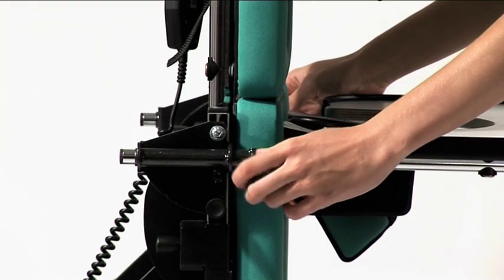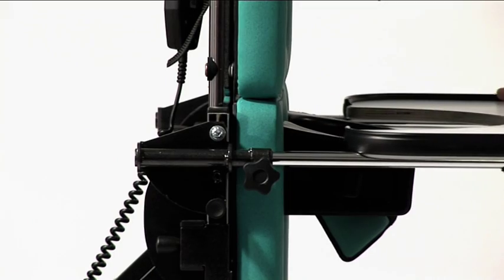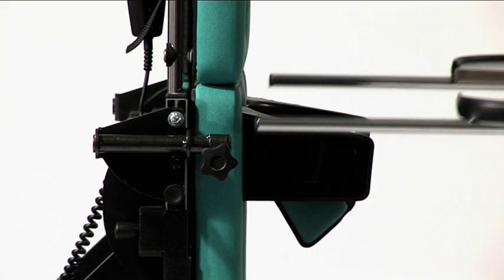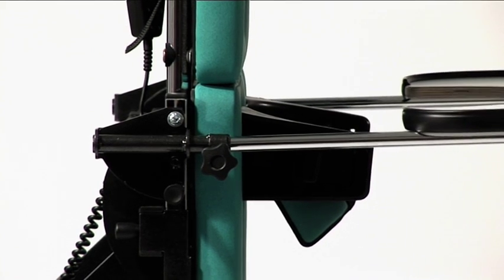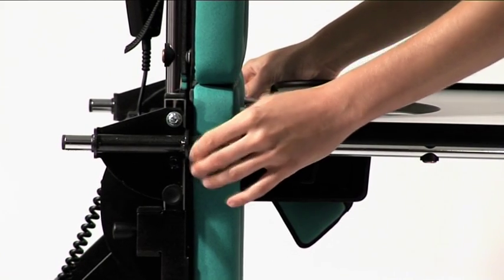The tray can be removed from the Supro by loosening the lever locks on each side of the main frame. The tray can then be removed by pulling. To refit the tray, offer up the tray tubes into the outer receivers. Insert and tighten with the lever locks.